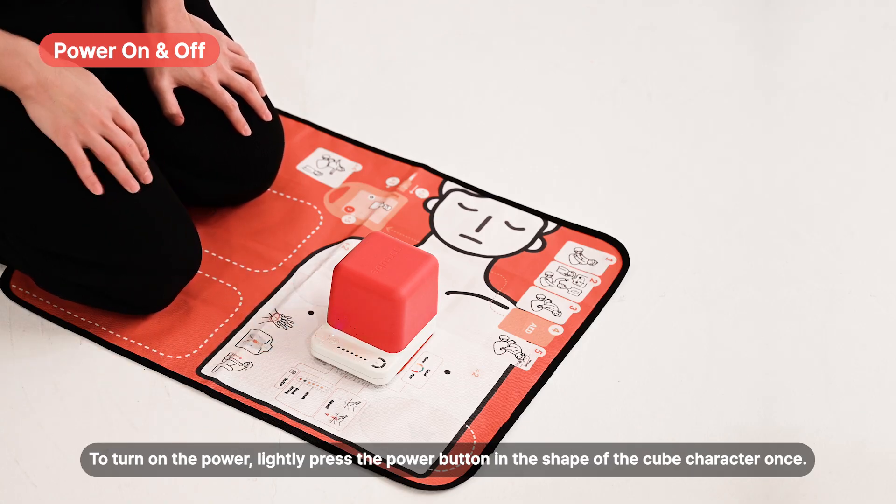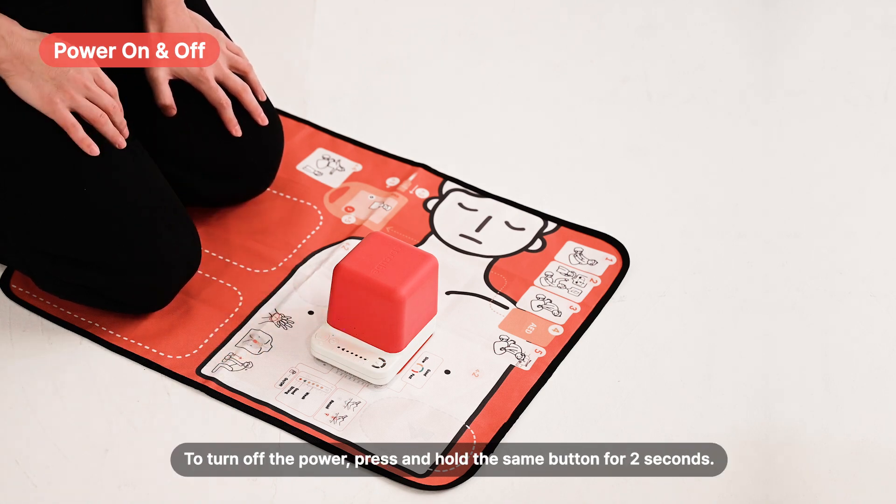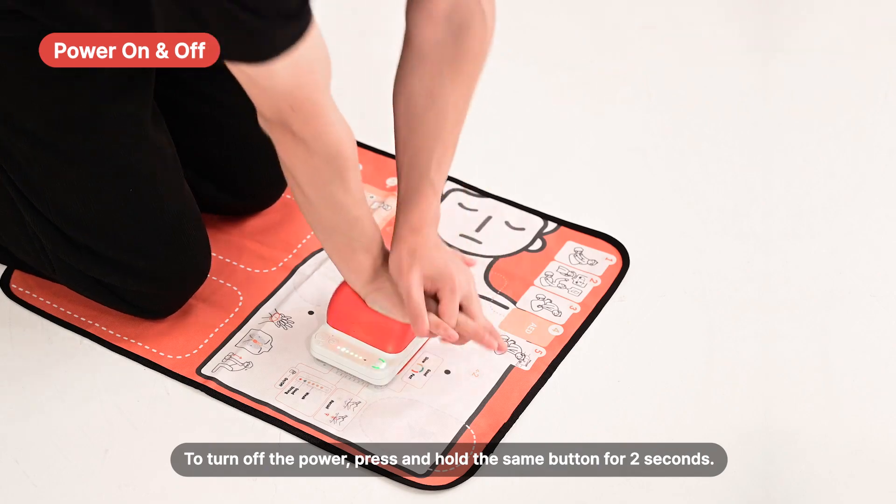To turn on the power, lightly press the power button in the shape of the cube character once. To turn off the power, press and hold the same button for two seconds.